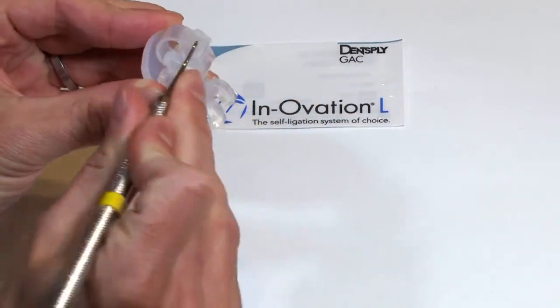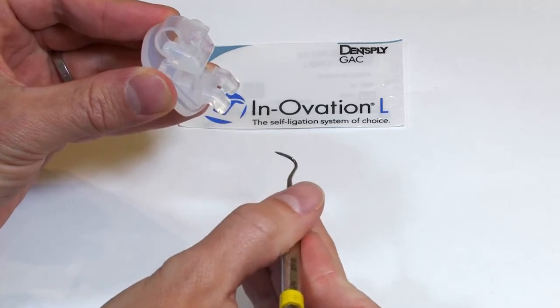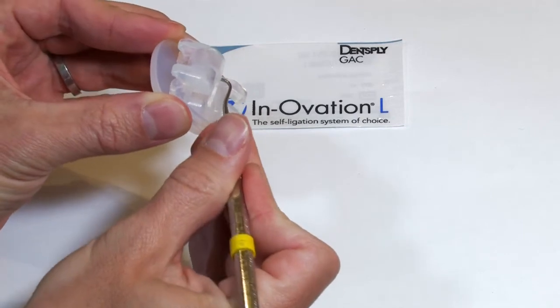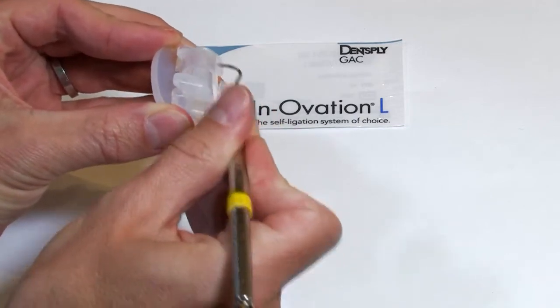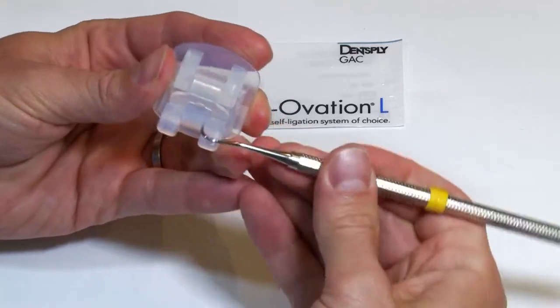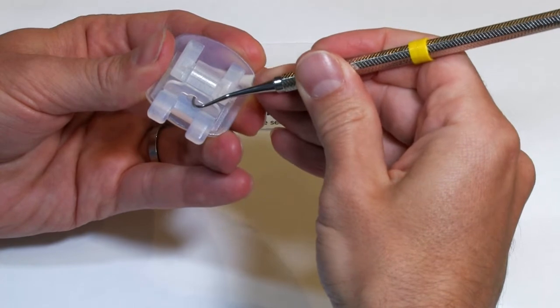So the door is going to pivot open — it has a rotational opening on the front teeth. And to close it you can use that scaler to just push it closed. So open and close, and from the front you can see there's this little cutout where that scaler is going to go in.